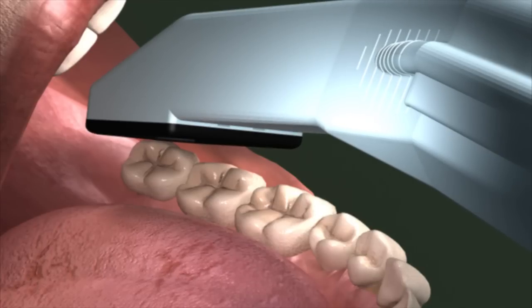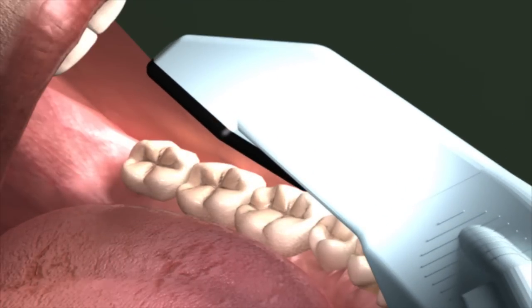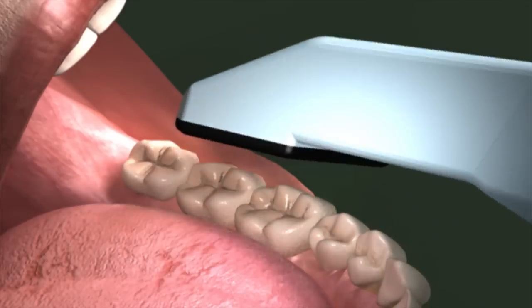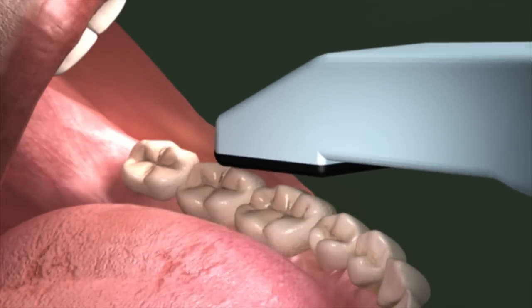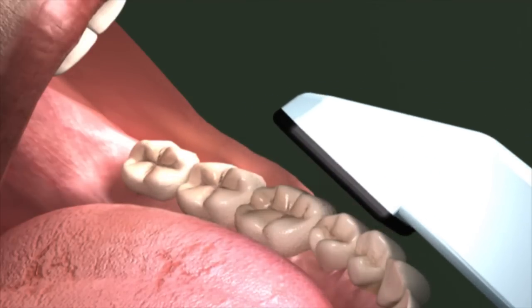Moving the wand forward approximately one tooth length, rock it so the inside tip of the scanning surface is now pressed against the tooth surface, then take the next scan. Continue moving the wand forward approximately one tooth at a time to ensure there's overlap between the two scans. Repeat this pattern until the entire buccal quadrant is scanned.